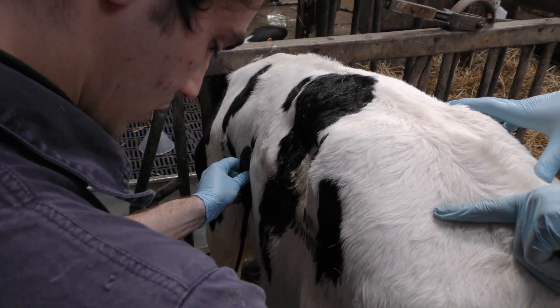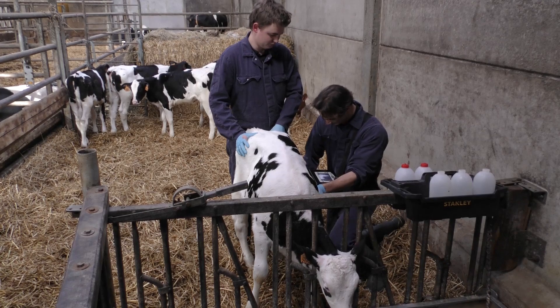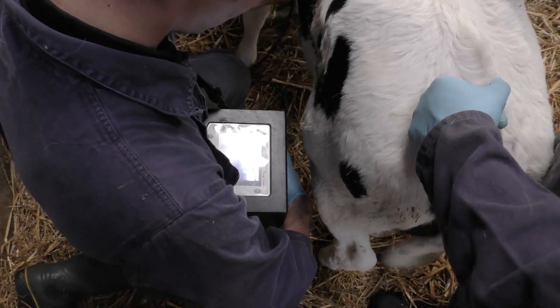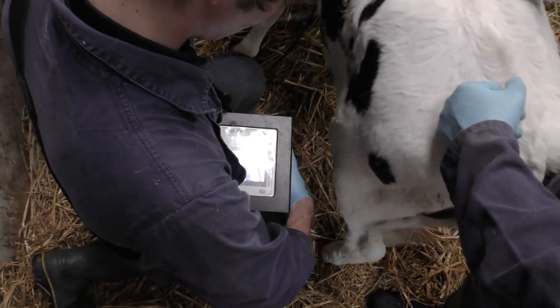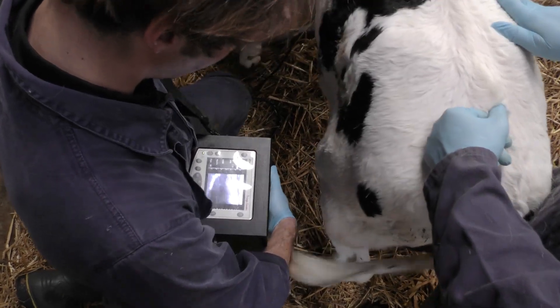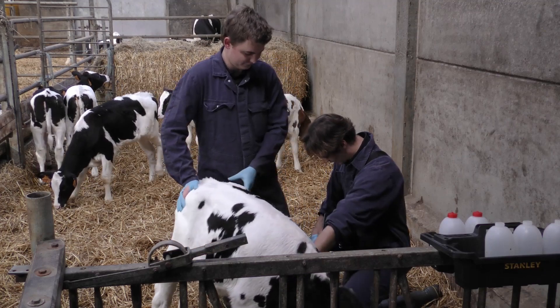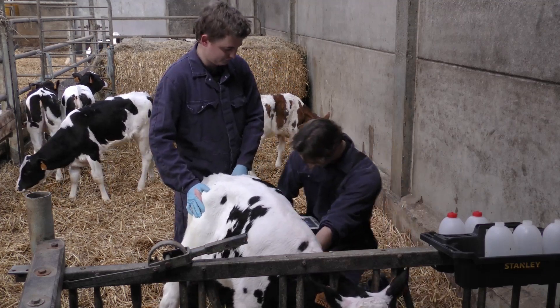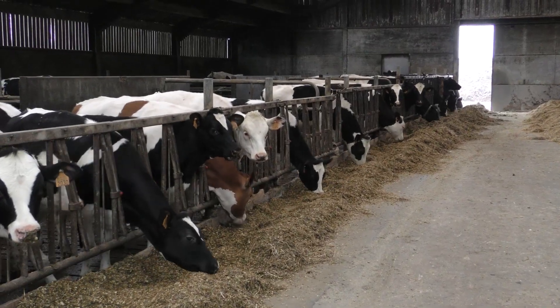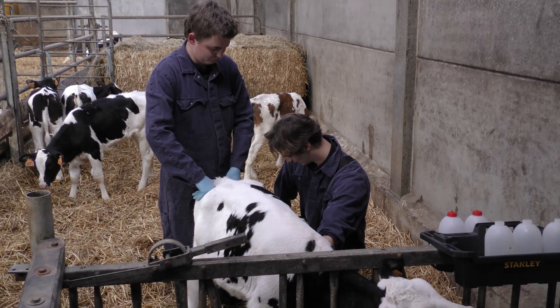We brengen de long in beeld. Hier zien we ook gezonde longkwabben. En wanneer we hier naar voren bewegen tot aan het hart, zien we eigenlijk dat dit ook gezond blijft. We zien reverberaties, wat wijst op gewoon de luchthoudende long. We gaan voor het volledige scannen tot aan het eindpunt. We zien dat er enkele kleine onregelmatigheden aanwezig zijn, maar verder geen duidelijke letsels.